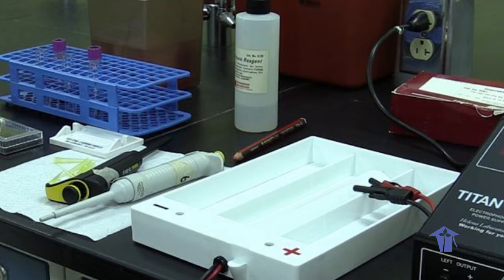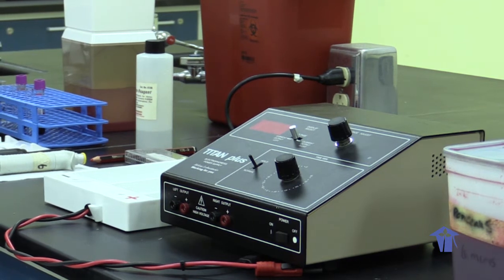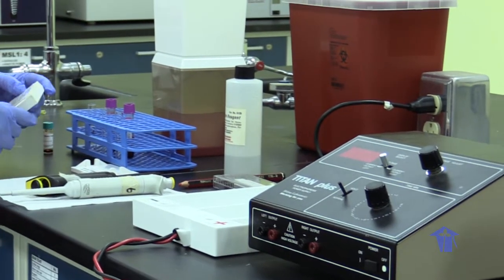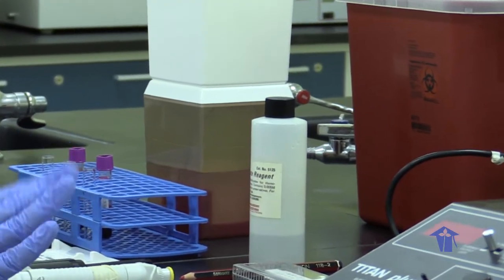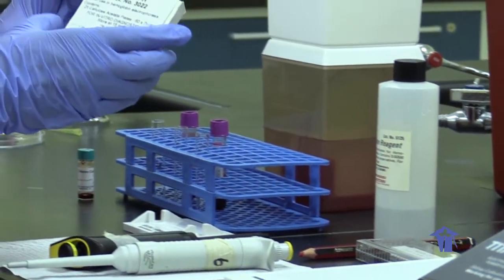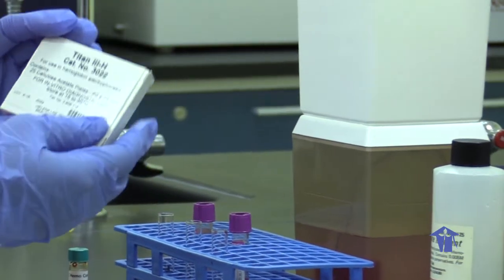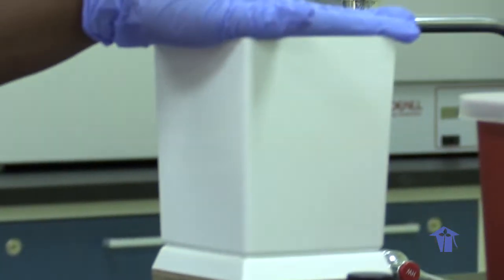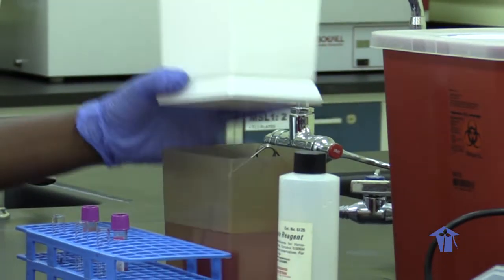And we'll have the lab techs again showing you what the procedure is like. Okay, so this is lab 9, as Dr. Campbell was saying. This is our hemoglobin electrophoresis setup here. We have our Titan cellulose acetate plates that we use. We soak these for a minimum of 20 minutes using the Super Heme buffer.